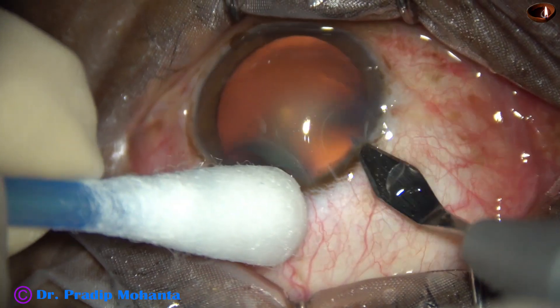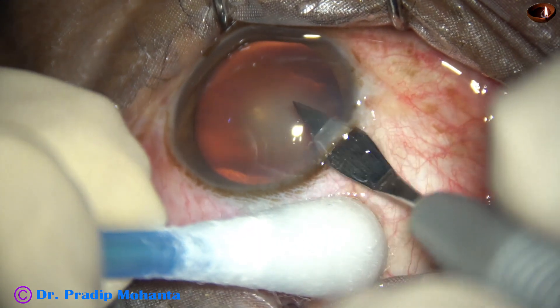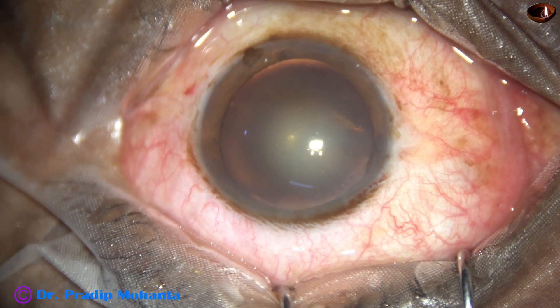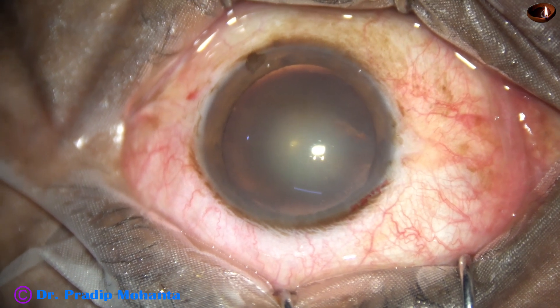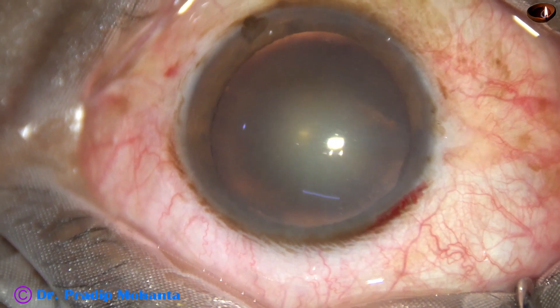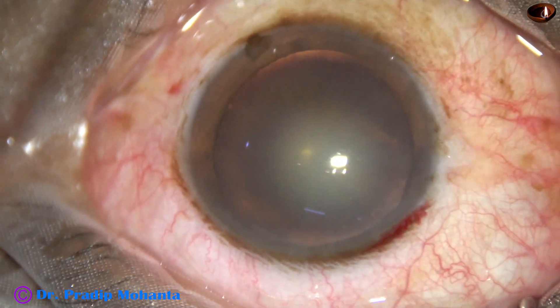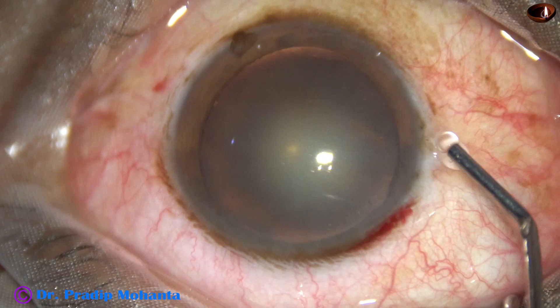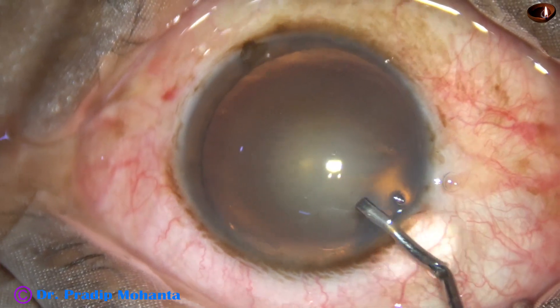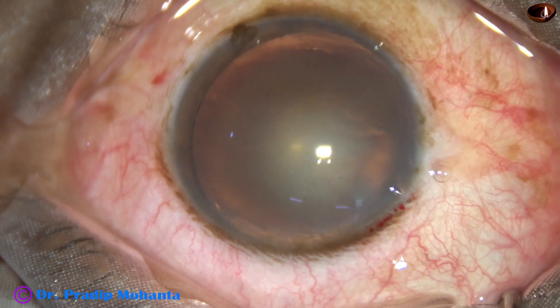This is the main incision with a 2.8 millimeter steel keratome on the posterior aspect of the limbus at around 11 o'clock. Now, at a little higher magnification, the anterior chamber is filled with 2% hydroxypropylmethylcellulose.